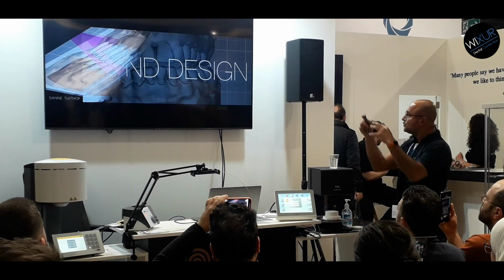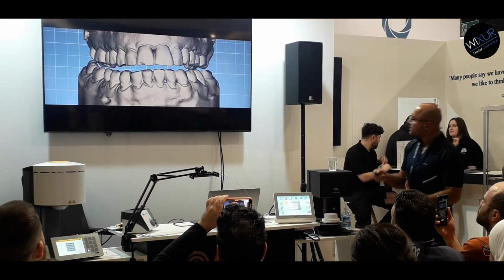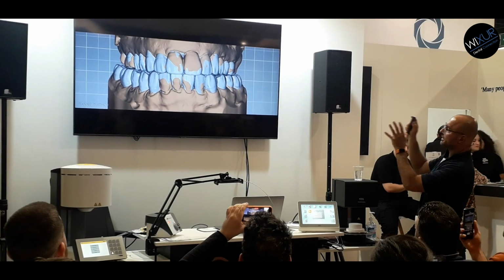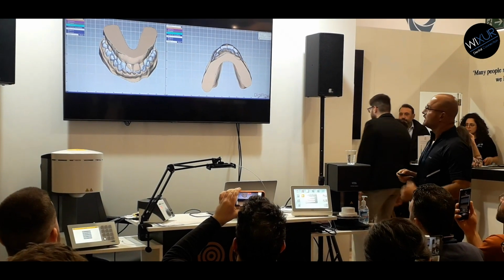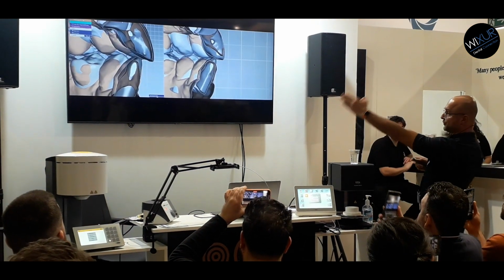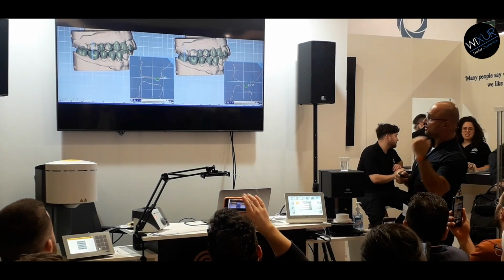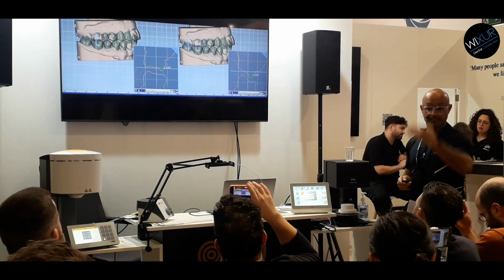So we need now to stay in the aesthetic, stay in the function, and create something nice. So I made the centrals smaller again. I made end-to-end. It was also not good. So we were playing with the wax up until we had the right design. So the first one, second one, and the third one. Now I give the information where she needs to grind. This is also very nice to communicate digitally with your dentist in order to grind it.